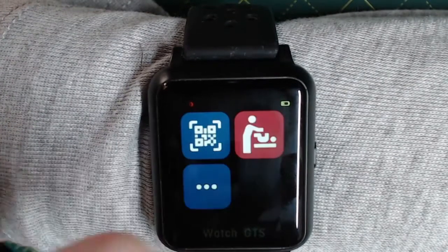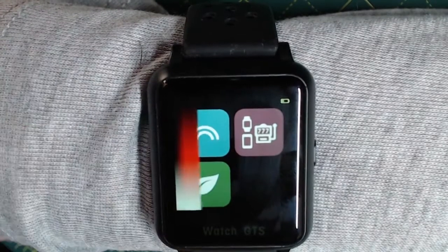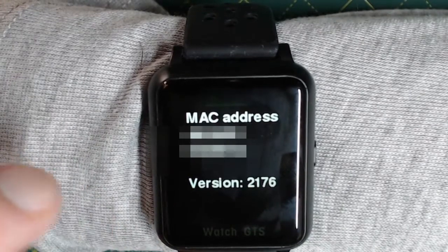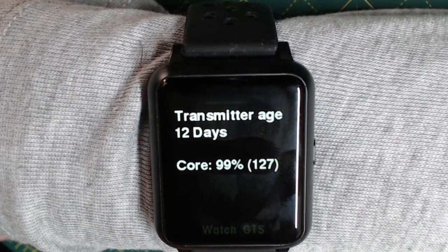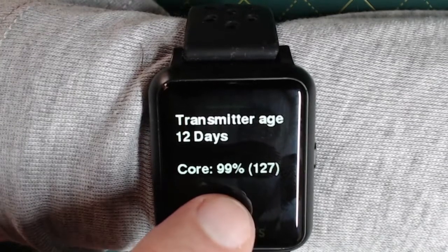The top-left rainbow icon is just to test the screen — here you can see it displays the full range of colours. There's also the information menu, which shows the MAC address and the version, and also gives some information about the transmitter age in days and the percentage of times that the Core has successfully connected to the transmitter.